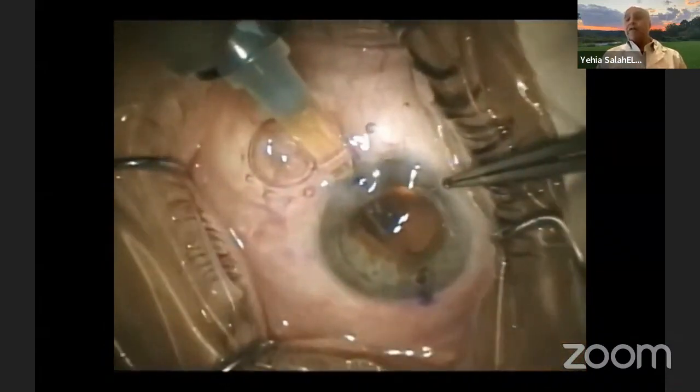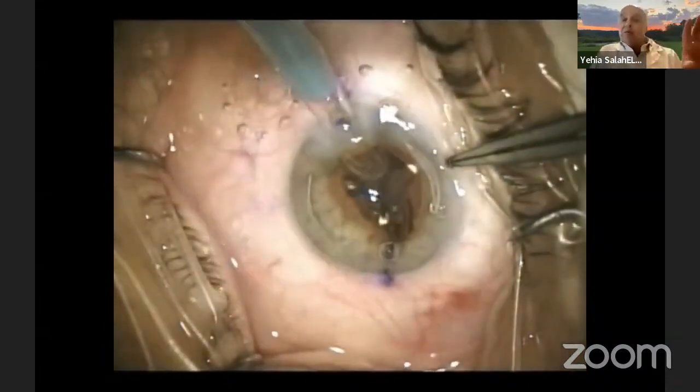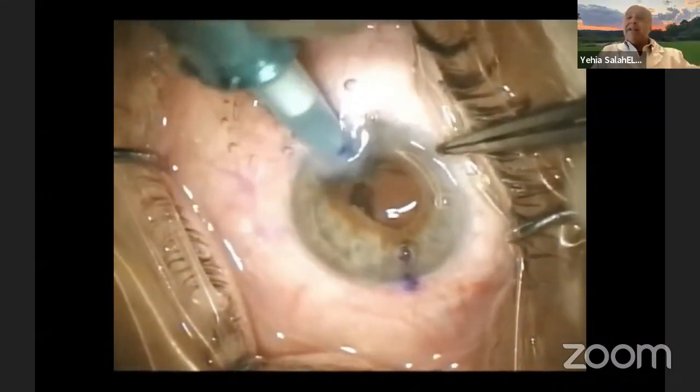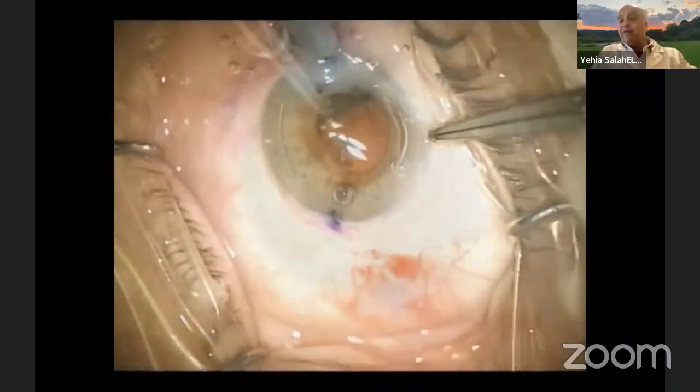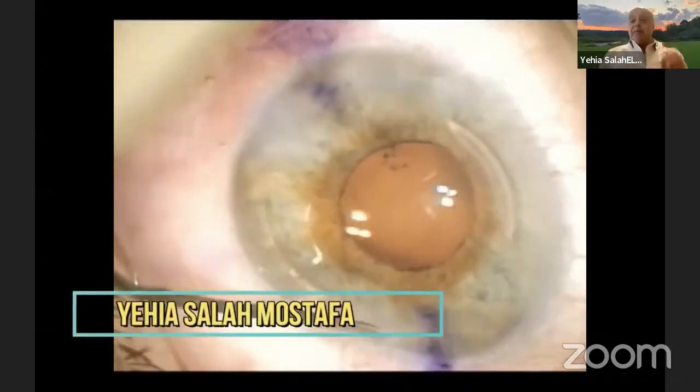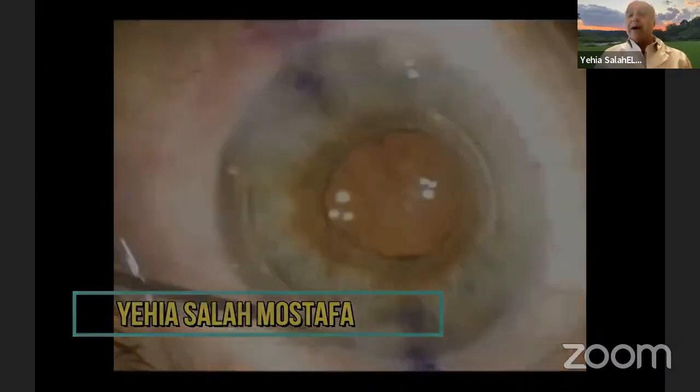this range of astigmatism. So the femtosecond laser has additional value in multifocal or premium lenses, but in my opinion, one of the main things is combining astigmatic keratotomy.